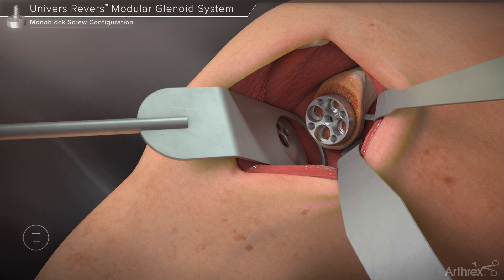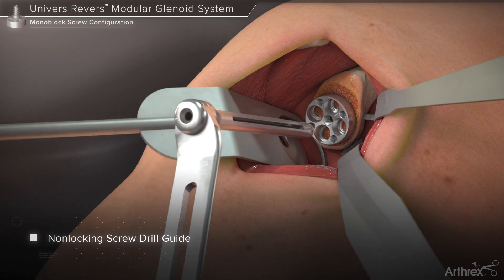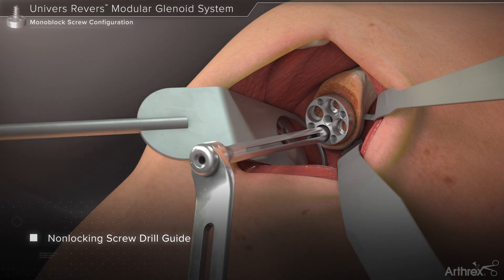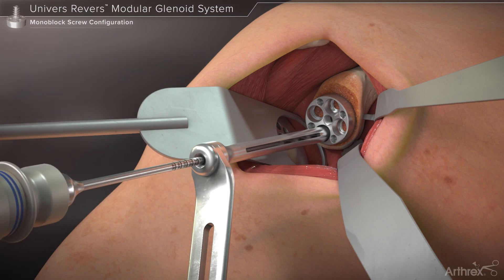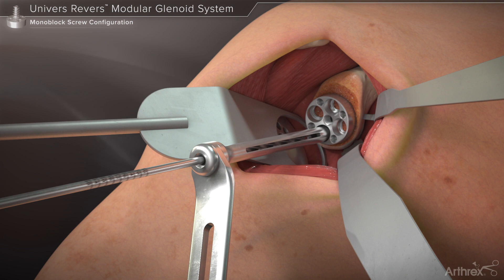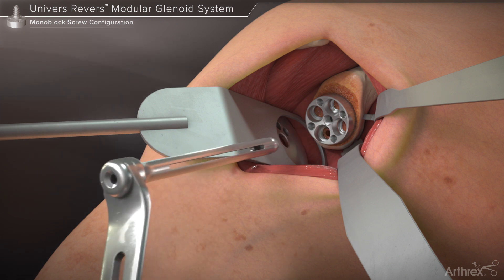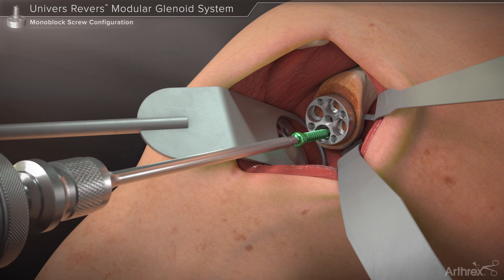For non-locking screw preparation, the variable angle non-locking drill guide is inserted into a peripheral screw hole and directed toward the desired screw trajectory. The 3 mm drill bit is then used to create the hole for any peripheral screws. The numbers on the drill bit shaft should be noted as they indicate the length of the peripheral screw to be used. The drill guide is removed from the base plate and the screw is inserted using the hex driver until it is fully seated within the base plate.